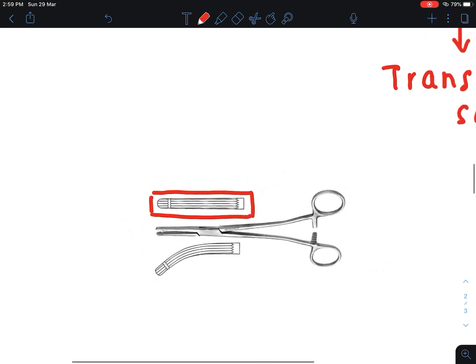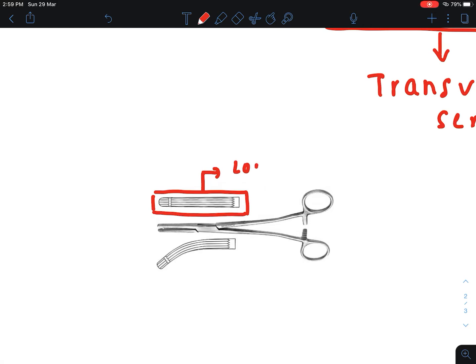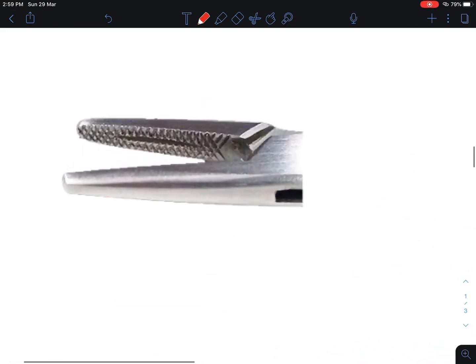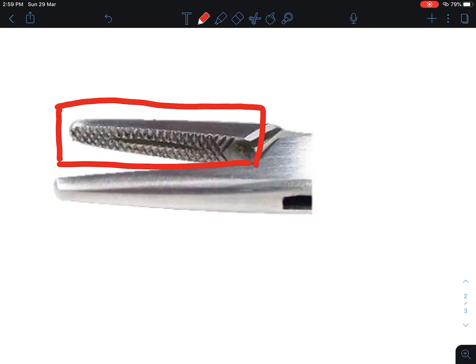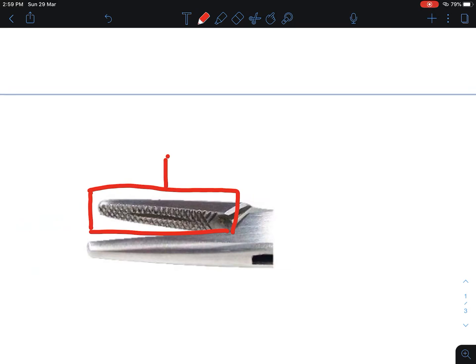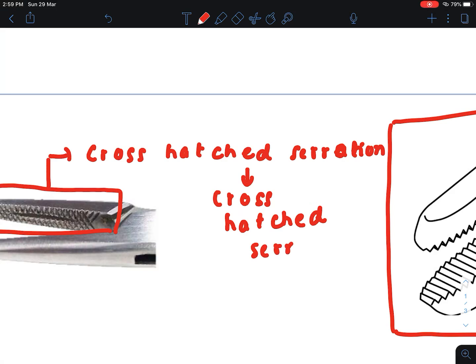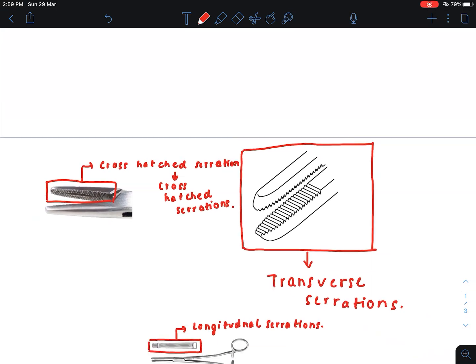The second type of serrations is longitudinal serrations. Longitudinal serrations are seen in intestinal clamps. The third type is cross-hatched serrations.